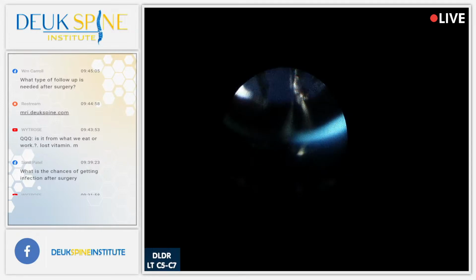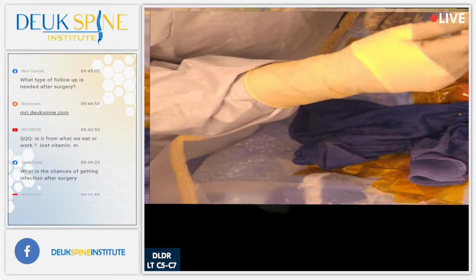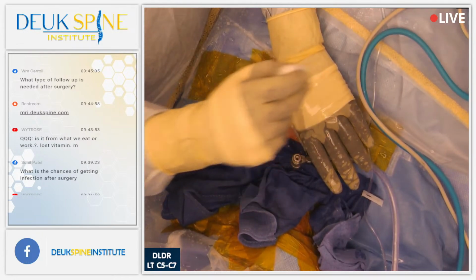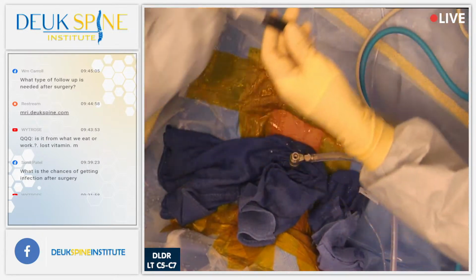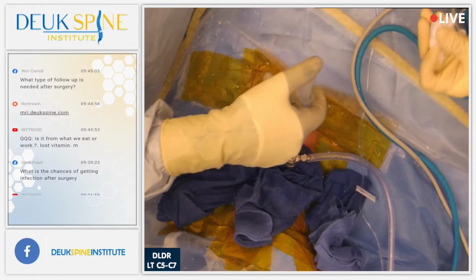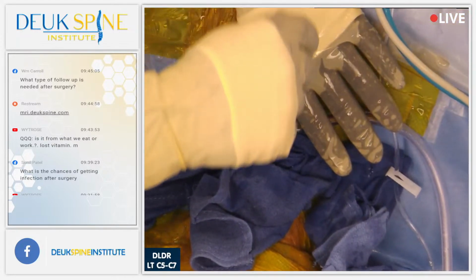Looks good. So I'm going to come and answer your questions. Feel free to type them up. I'll be there in 5 minutes. But I do want to show you all the whole surgery was done through this tiny, tiny tube. And again, this is endoscopic spine surgery at its finest.